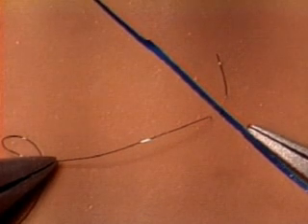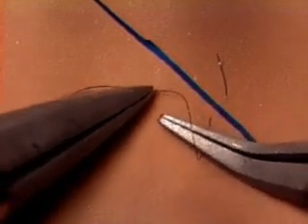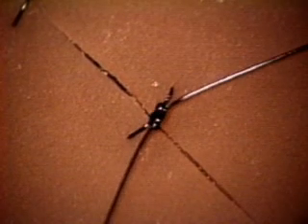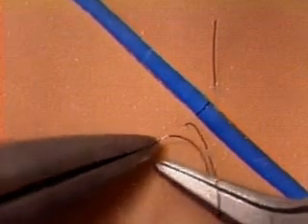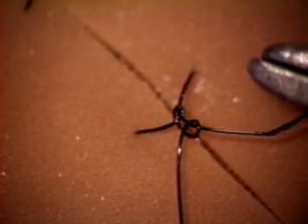Another important detail, if you come as I showed you from above the thread and make your loop this way round, you'll end up with a half knot which lies flat, and that's the first step toward a good square knot. If instead you come from below and make the loop the other way round, you'll get a half knot that lies awkwardly, and you're likely to end up with this instead of this.